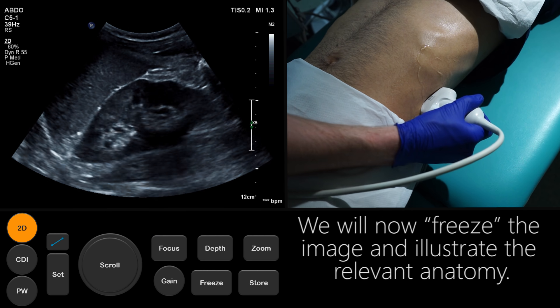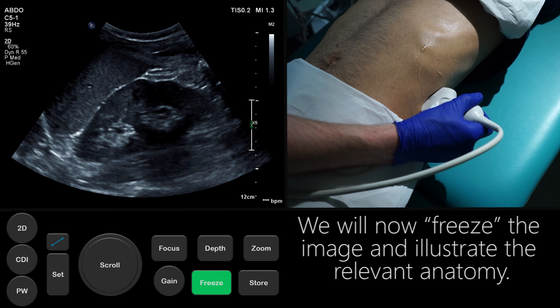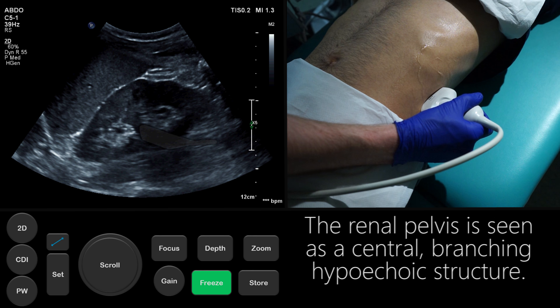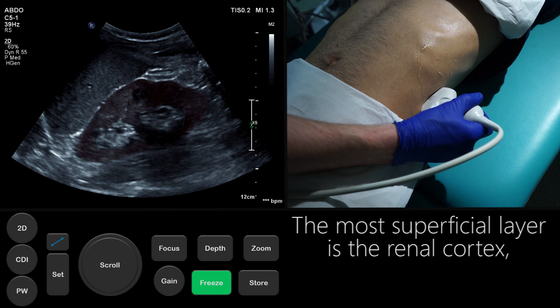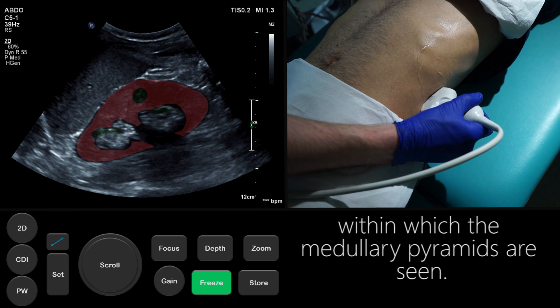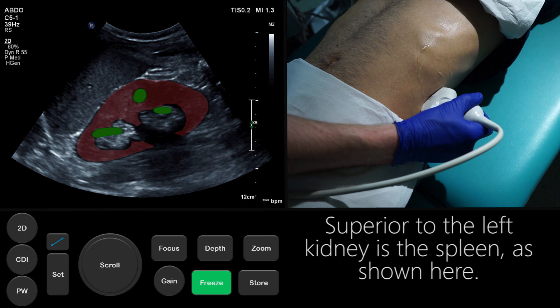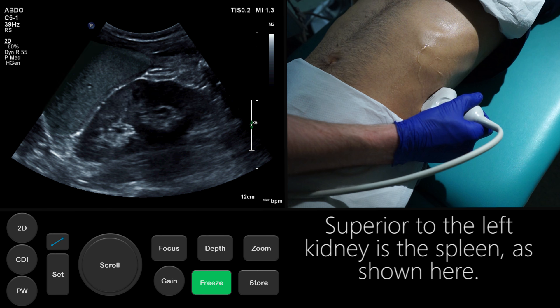We will now freeze the image and illustrate the relevant anatomy. The renal pelvis is seen as a central, branching, hypoechoic structure. The echogenic sinus fat can be seen centrally. The most superficial layer is the renal cortex, within which the medullary pyramids are seen. Superior to the left kidney is the spleen, as shown here.